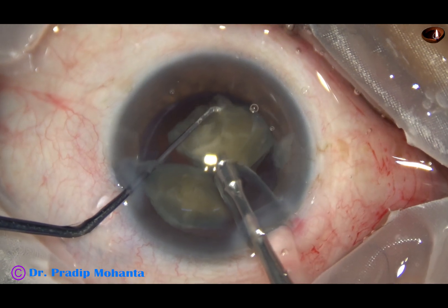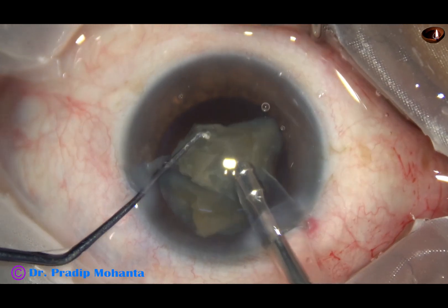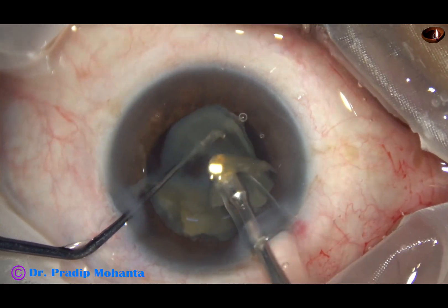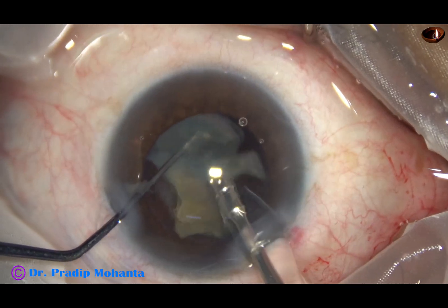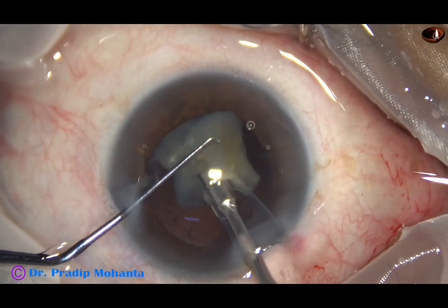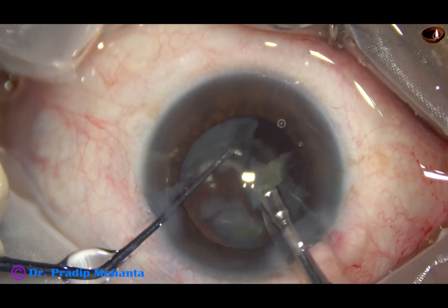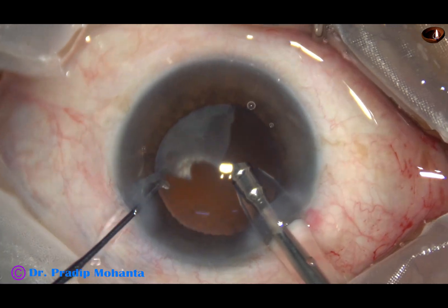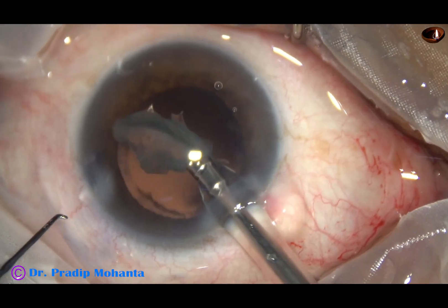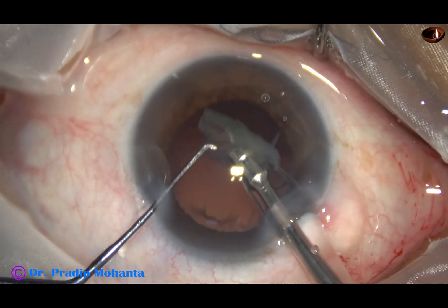The phaco machine is Oatly Catarix 3, and the microscope is OMS 800 from Topcon. Now see this — I have detached the epinucleus. The epinucleus was acting as a cushion to protect the posterior capsule.